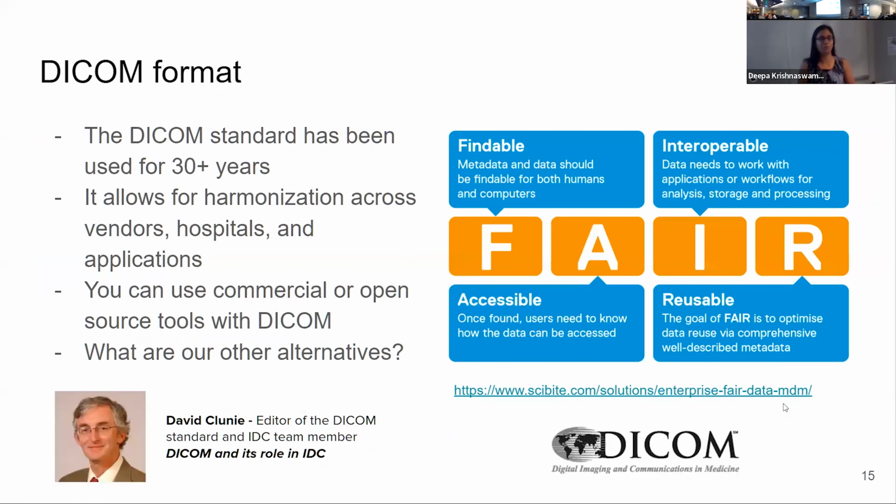So you might be wondering what type of format we actually store all this data in. Maybe some of you have heard of the DICOM format. This is a pretty standard format in medical imaging, and it's been used for over 30 years. The great part about DICOM is that you can use it for harmonization across many different vendors or hospitals. You've probably used it in many applications, and you can use it in commercial or open source applications as well.